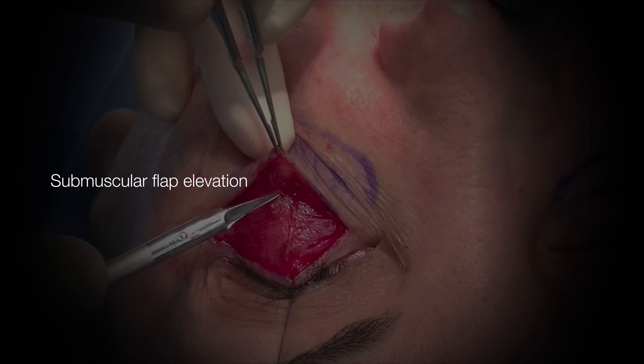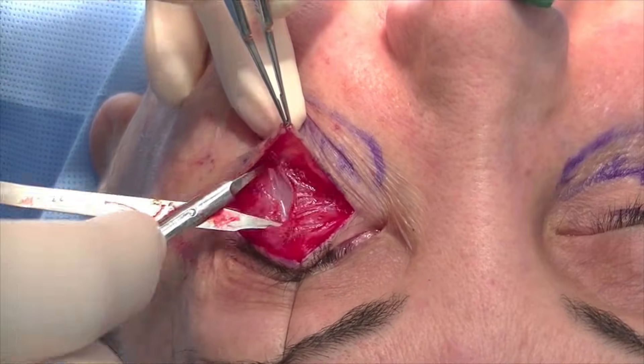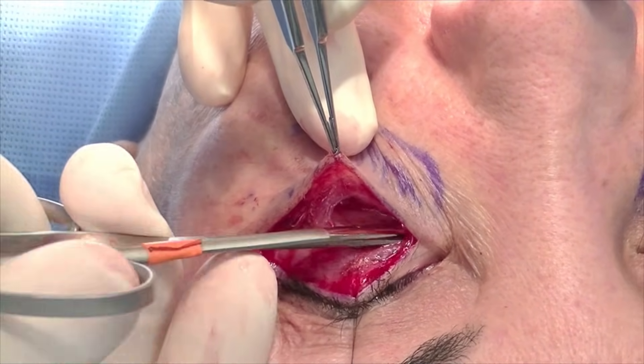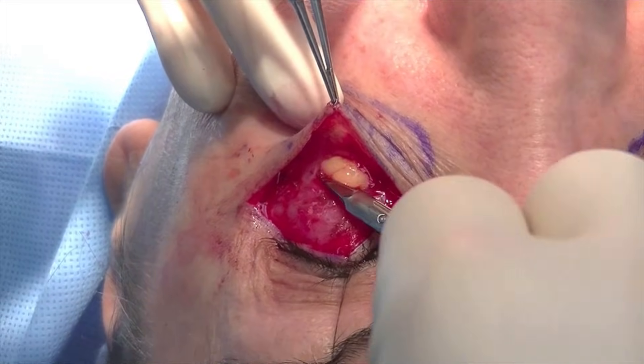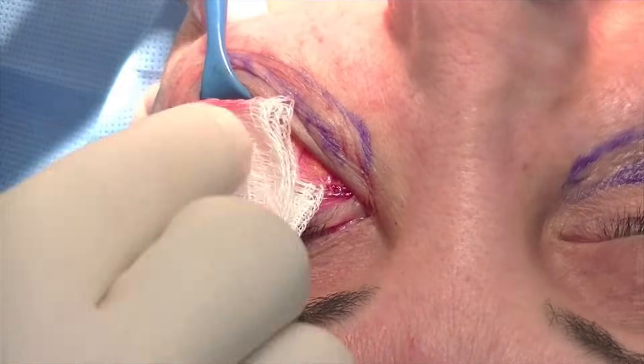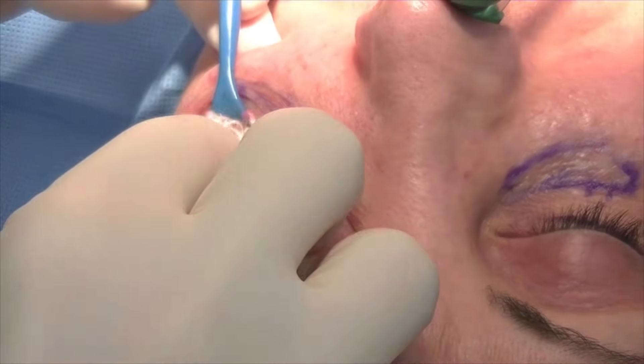A submuscular flap is then elevated at the most inferior point of the dissection by piercing the orbicularis. You can see the orbital fat and orbital septum poke through. This flap plane is then dissected medially and laterally to expose the area just above the orbital rim.